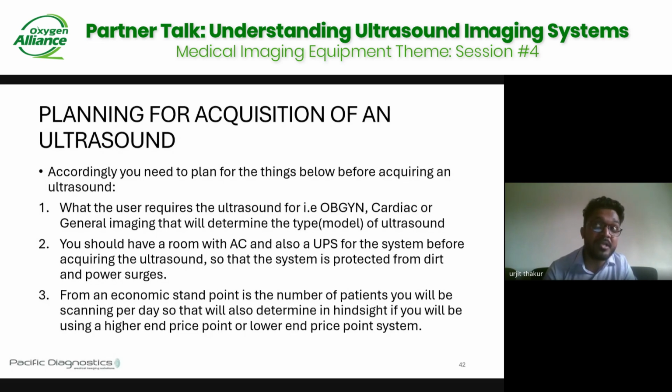And also, we always advise the customer to have a UPS. That means the system should be on a UPS. In case there's a power surge, which we have a lot of here in Africa, it can damage the boards as well as cause corruption with software. At the end of the day this causes inconvenience to the customer as well as to us, because we as the engineers have to go, order the board and replace the board, and reloading the software also takes a bit of time. So this all can be avoided with the UPS.